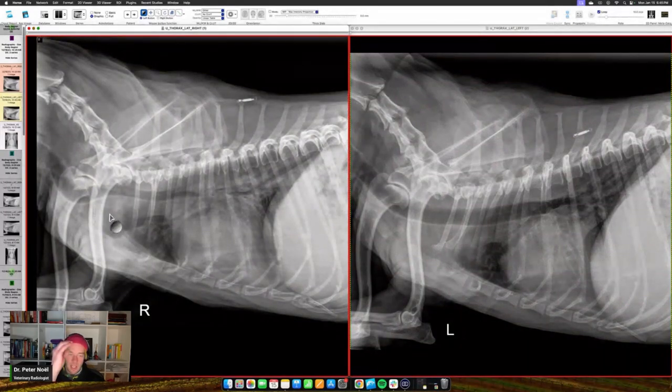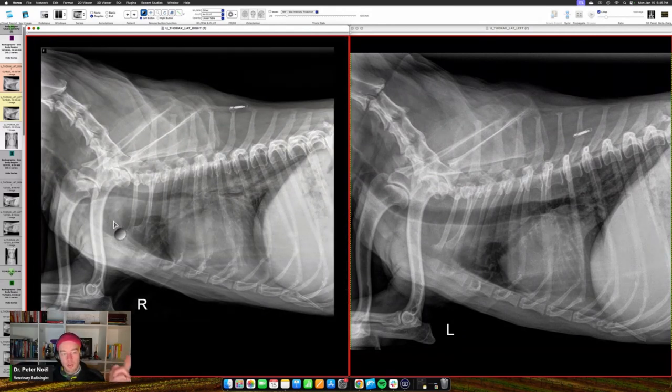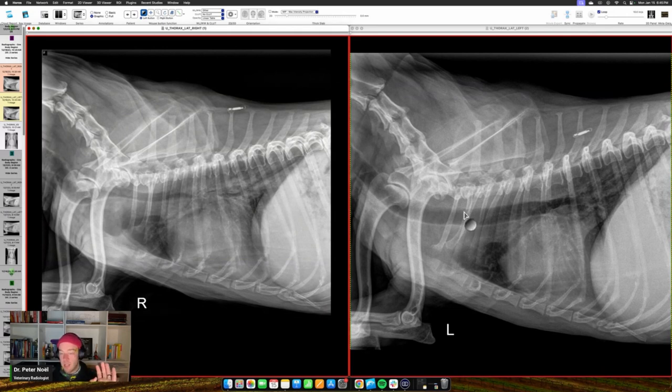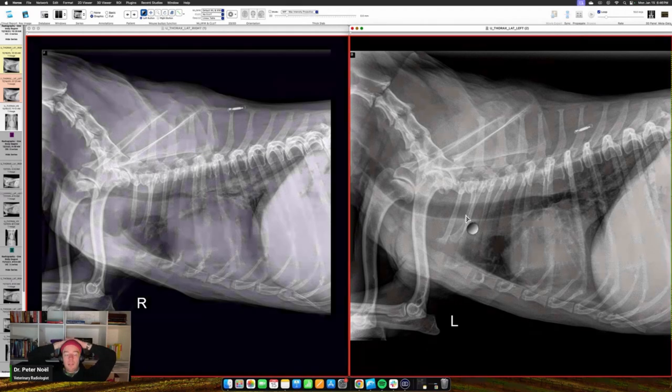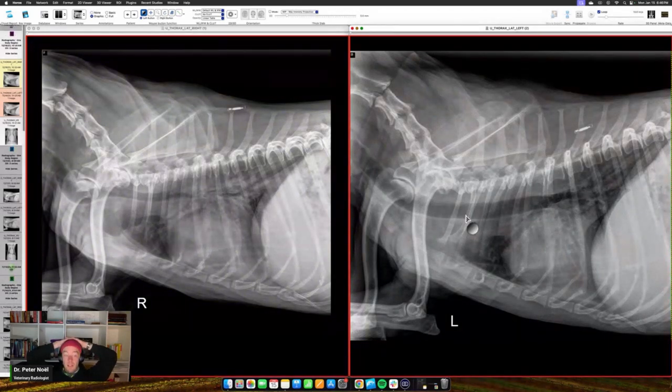That's the lung. So with this intrathoracic collapse, the dog either coughs or is expiratory and pushes, and he can't get that air out. So it just goes boom, straight down into the lung lobes, and those things go cruising through the thoracic inlet. Okay, so this is diagnostic, unless somebody wants to tell me otherwise, for collapse of the principal bronchi, like the carina area. And I think the degree of narrowing of the intrathoracic trachea is also concerning.